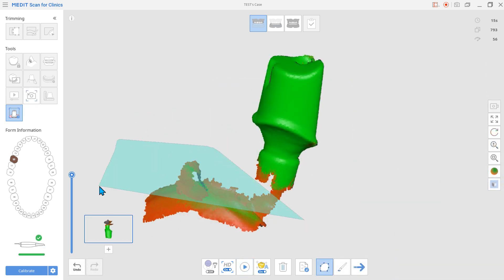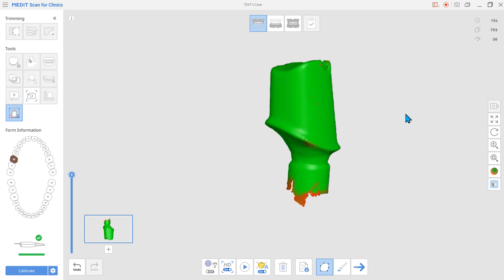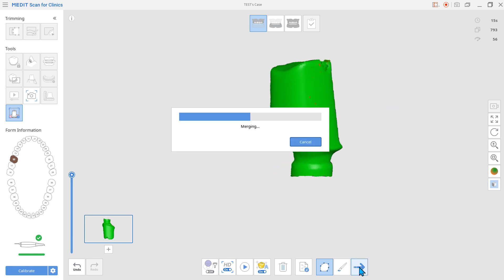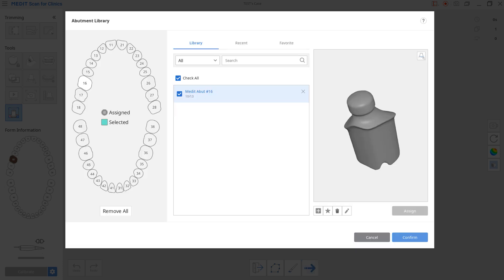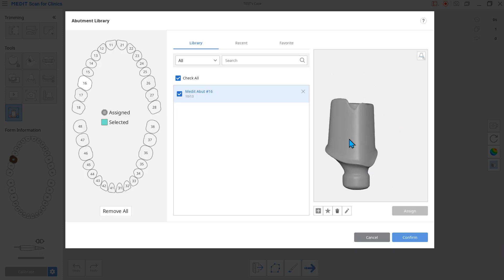Edit out the unnecessary data after scanning. After registering the library's name, click Confirm. Registering an abutment using the scanner is now completed.